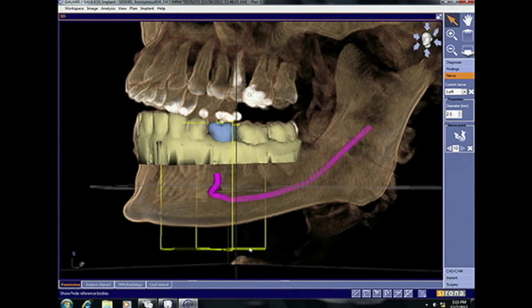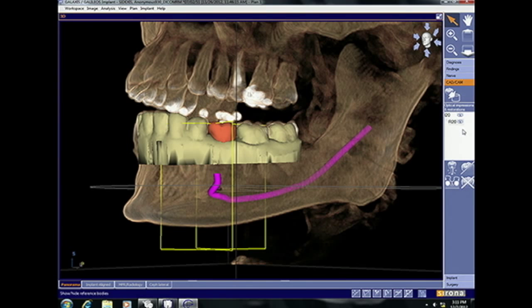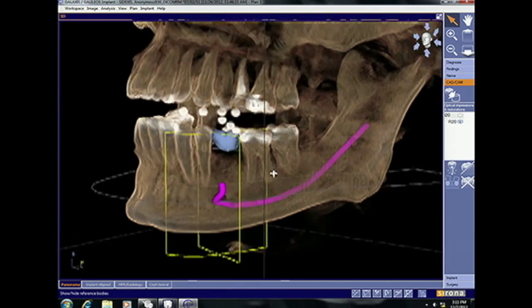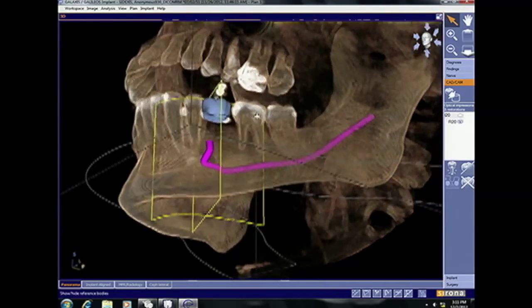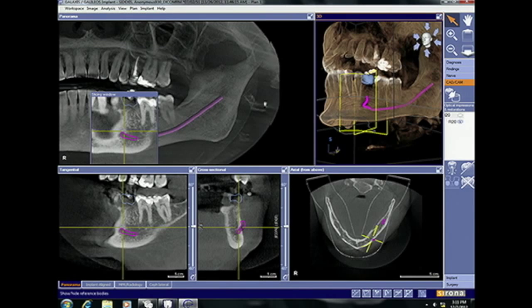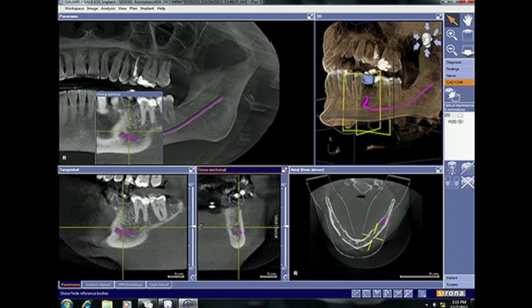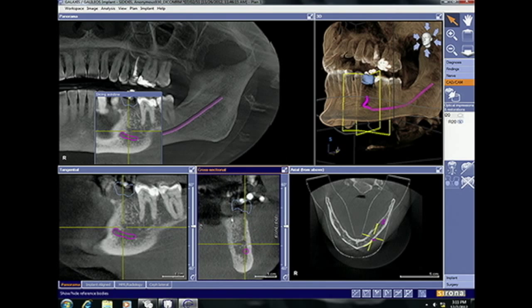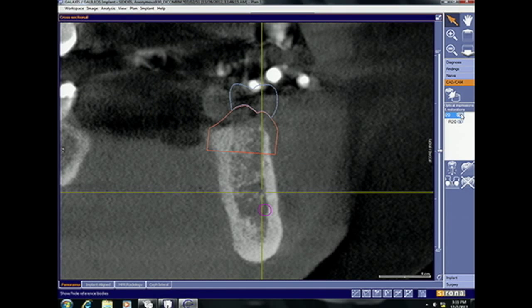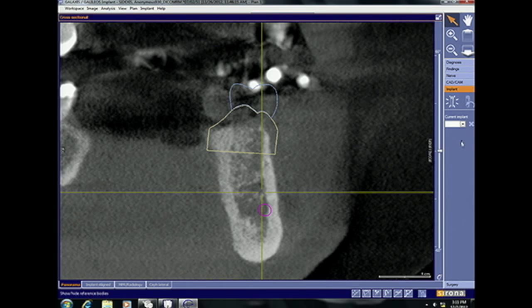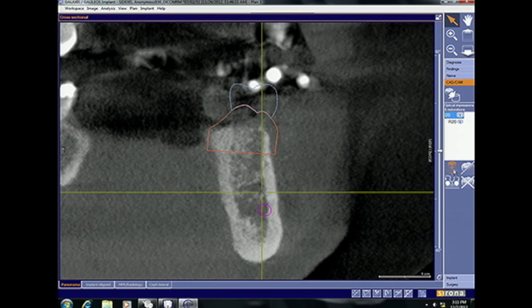At this stage, I'm ready to plan my implant. But prior to doing that, I'd like to show the functionality of the CAD-CAM tab. It's easy for a clinician to hide and remove the optical impression in order to evaluate the restoration and its relationship to the anatomy. We'll switch back into the full software and look at the crown in the cross-sectional view and see the outline of the crown relative to the anatomy. When I toggle on the model, you'll see the thickness or biotype of tissue relative to the hard tissue. Within the software we have multiple ways of placing implants — we can use the implant tab on the right-hand side, but since we've integrated a CAD-CAM file, there's also an option within the CAD-CAM tab.